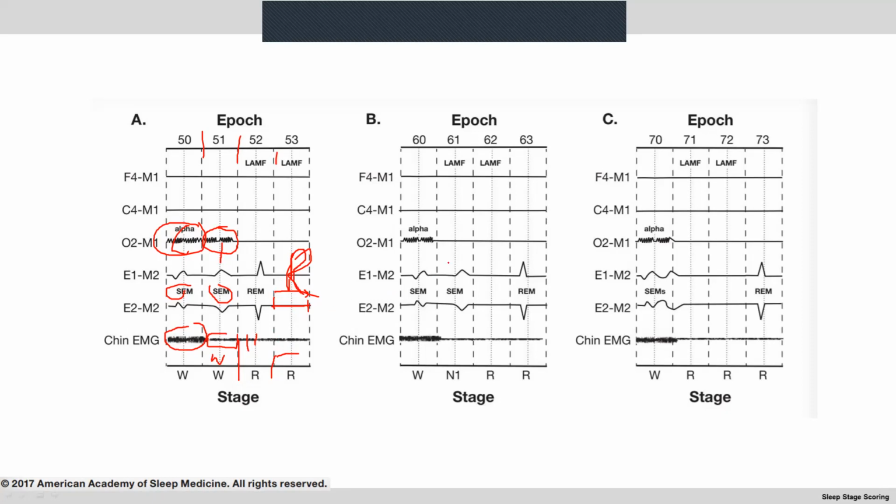Okay, please, if you have any doubt, please let me know. Again and again I'm telling, because we will conduct a quiz for you on this, to see how you will score about these stages. We will give you a similar kind of exercise, and then we will also discuss it at that time. If you are not in agreement with these stages, please let me know.